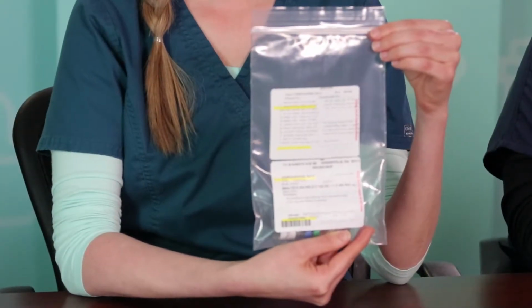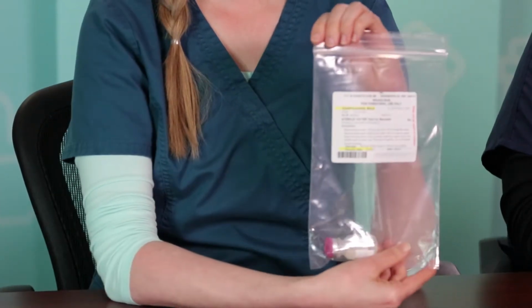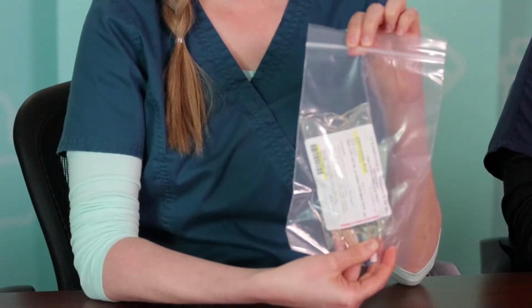As you're gathering supplies, make sure to check that you have the right patient name, the right medication, and the bag is not past the discard after date. We have a bag of medication, a vial with diluent, as well as the final bag for the preparation to be delivered to the patient.